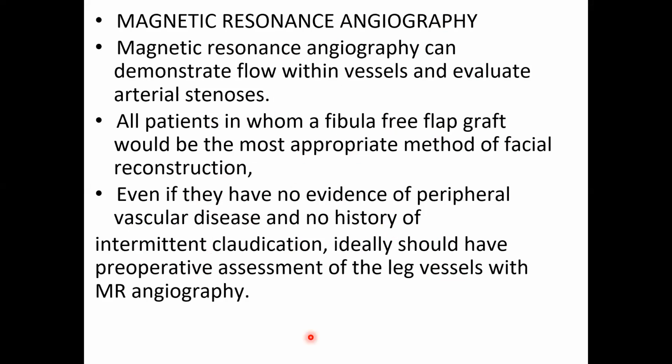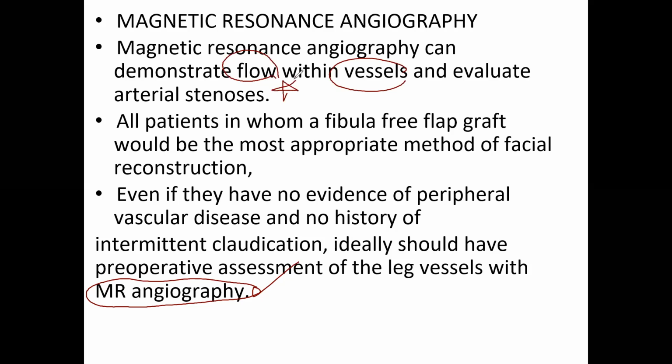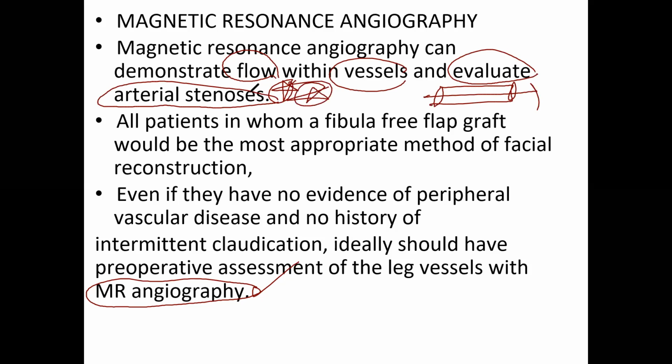So very importantly, everybody should undergo MR angiography. This is very important. Here you can see the flow within the vessels. How is the blood flowing within the blood vessels? That is what is seen in the MR angiography. It also helps in evaluation of the arterial stenosis. So how is the arterial stenosis? You are able to see that.